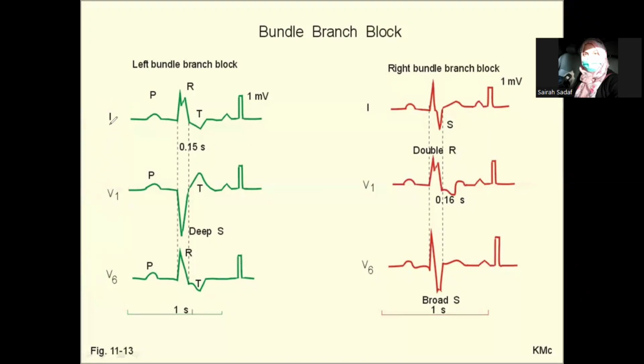The findings in lead 1 and V6 have to be the same, and V1 will be different from lead 1 and V6. First, just make this clear.